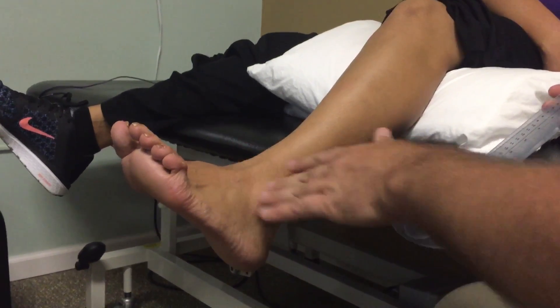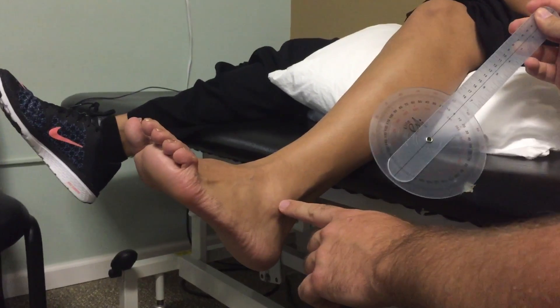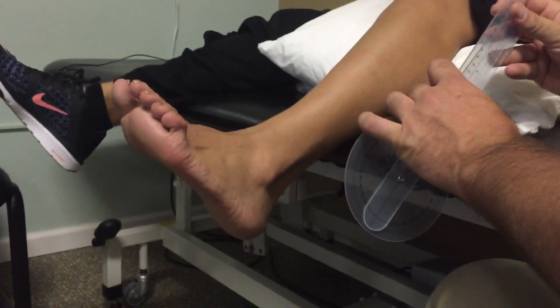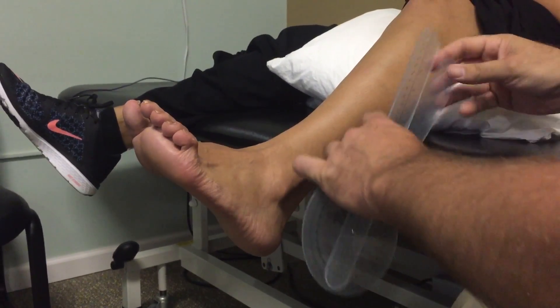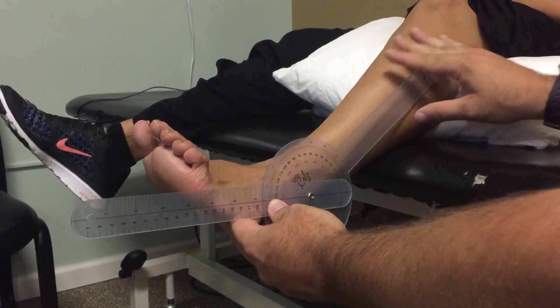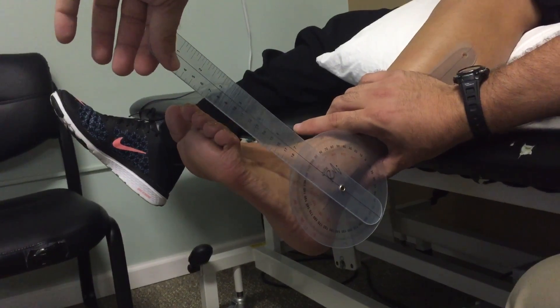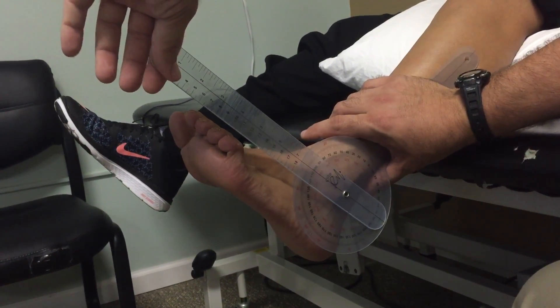When measuring ankle dorsiflexion, the axis of the goniometer is going to be lined up with the head of the lateral malleolus. The stationary arm is going to be parallel with the head of the fibula. The movable arm is going to be parallel with the fifth metatarsal.